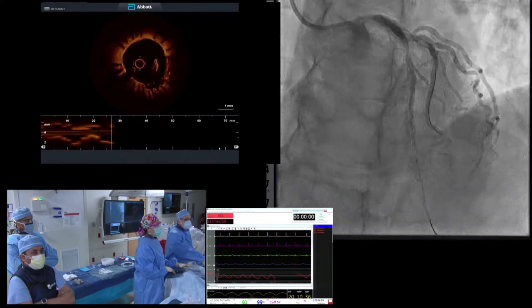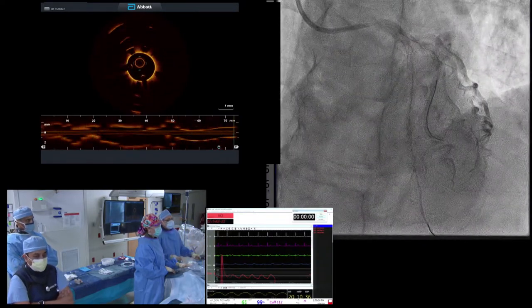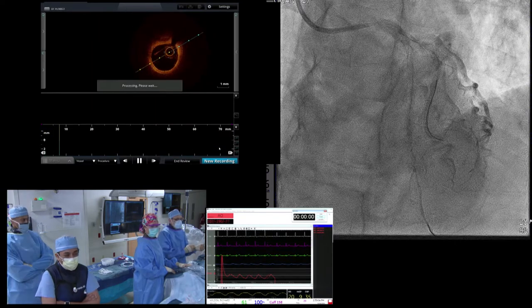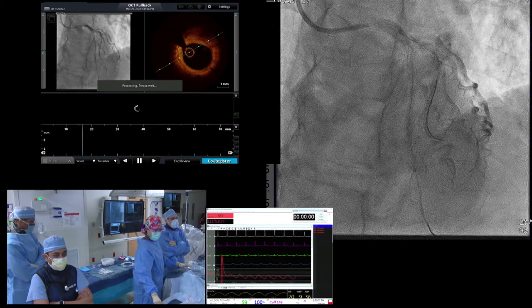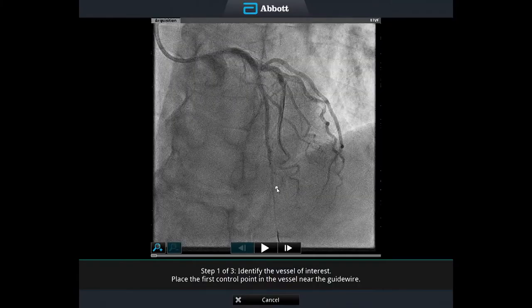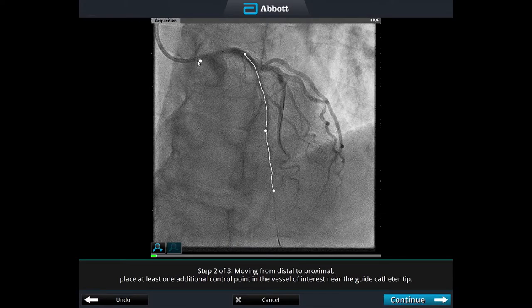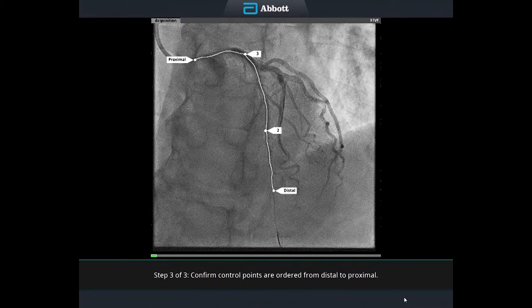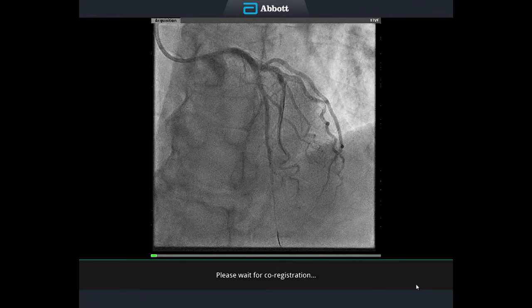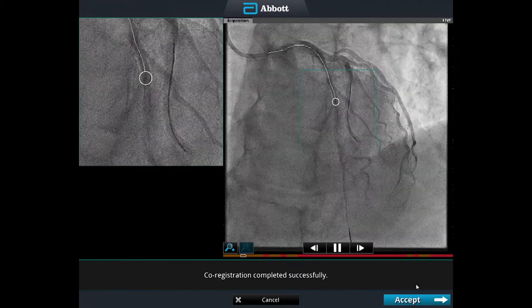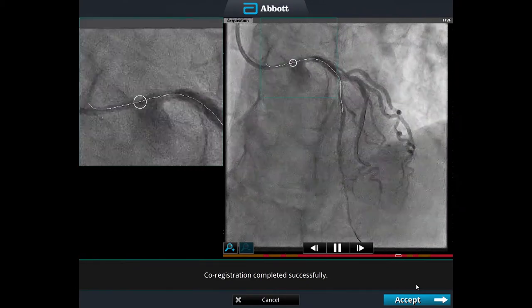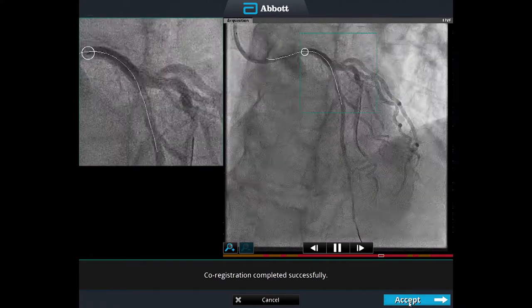Here we go — we're doing our OCT run. That's really good opacification. Bimal, Savni is going to run the pictures — why don't you tell us what you see and give us direction on what we need to do? We're using the co-registration system, so the software puts dots on the wire which co-registers with the OCT catheter and overlays on the angiographic picture. That takes a few seconds to finish.